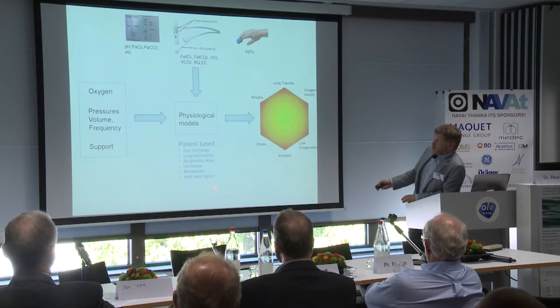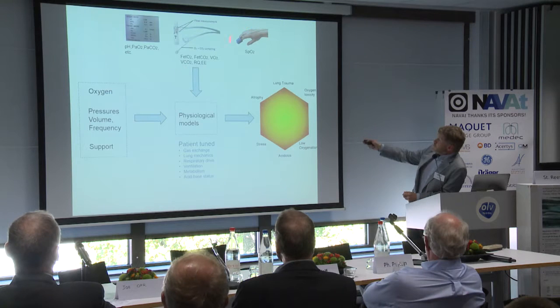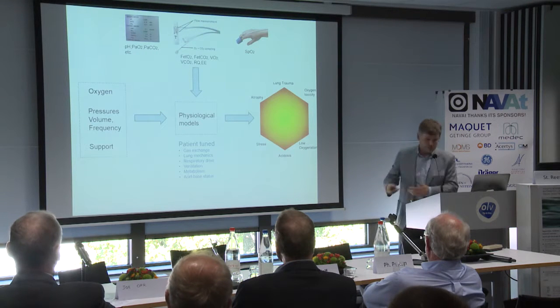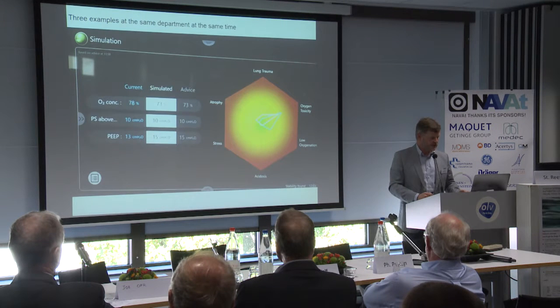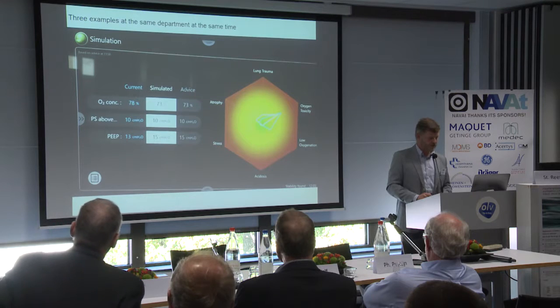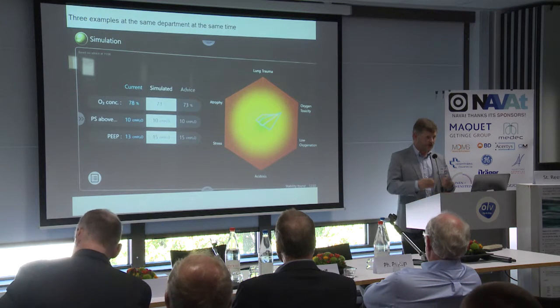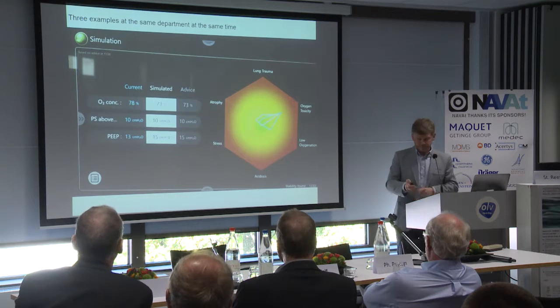So now we have the models, now we have the measurement. You type in the blood gas, you have the indirect calorimetry and SpO2, so the system functions in that way. And I'd like to show you a couple of patient cases, and I hope I don't overstep the mark and it feels like a sales talk, but we've been working on this so long, so I'd like to show you how it functions, and then reflect it back to the OR.